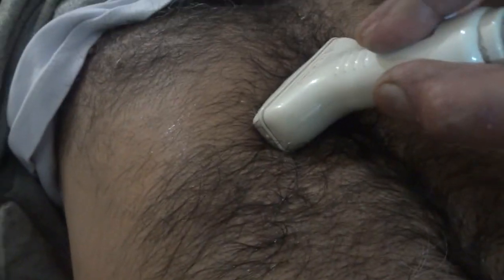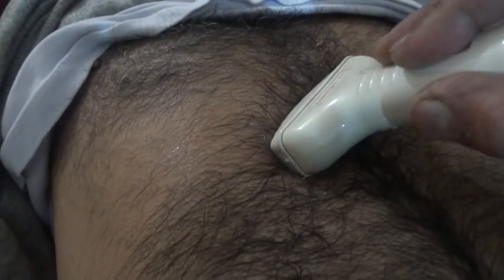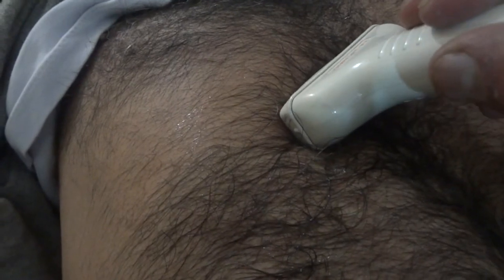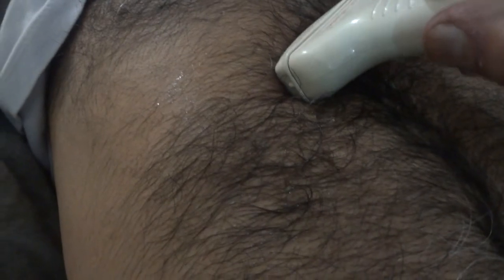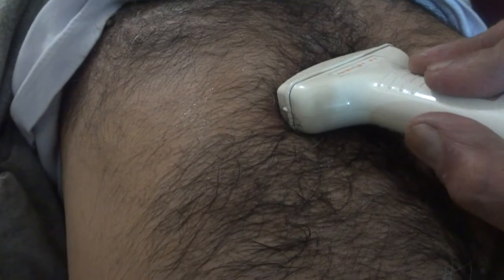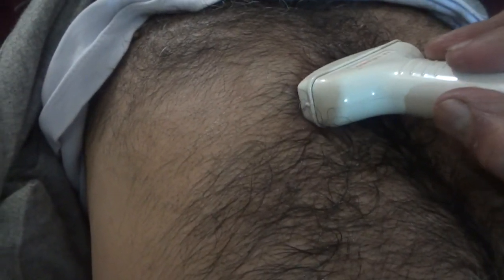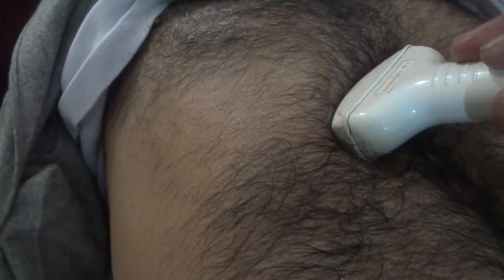You may have to ask the patient to take a deep breath and hold it in case you don't see the transverse section of the liver, the portal veins. In this posture and in this scanning plane, if you don't see the hepatic veins, then you may have to give pressure and maneuver it in this way.